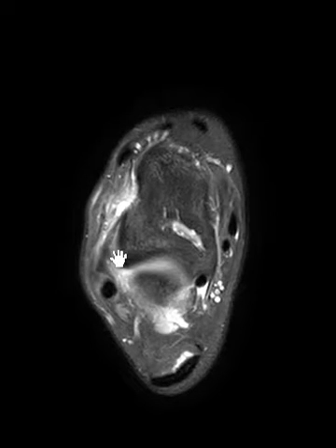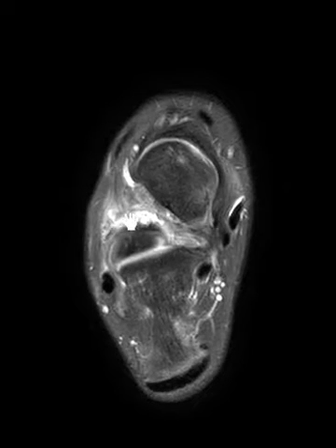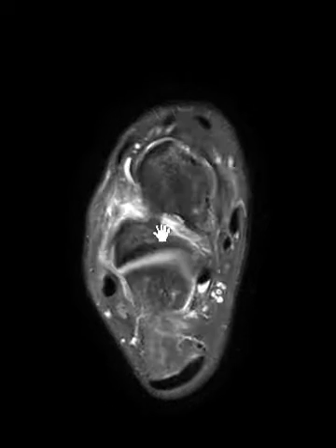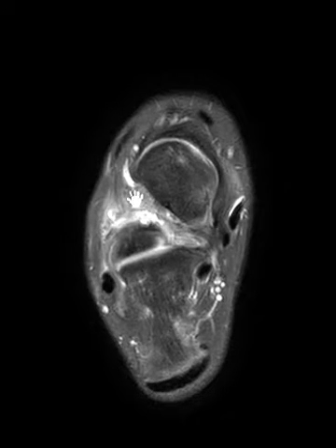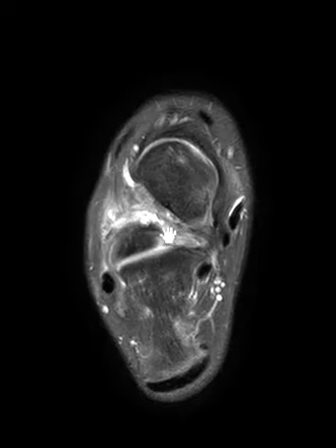So there's no high ankle sprain. Coming on down, we see that structure is intact — maybe partially torn or thickened from a prior sprain. As we go further down, we see fluid coming into this area — this is the sinus tarsi. There are ligaments in the sinus tarsi, and the fluid appears to go right through them, suggesting an injury. Often you see brightness here related to inflammation, which can be associated with sinus tarsi syndrome.